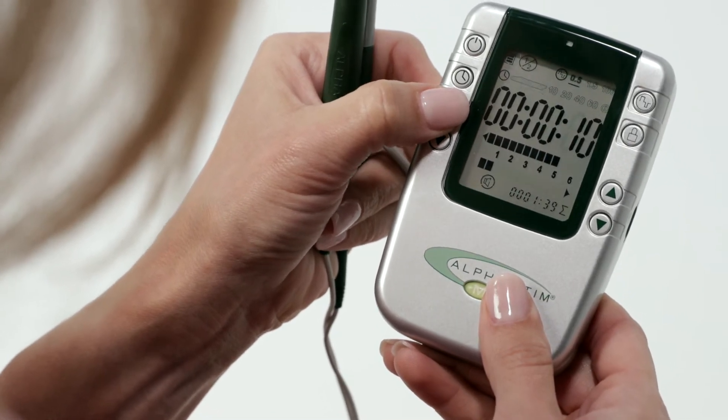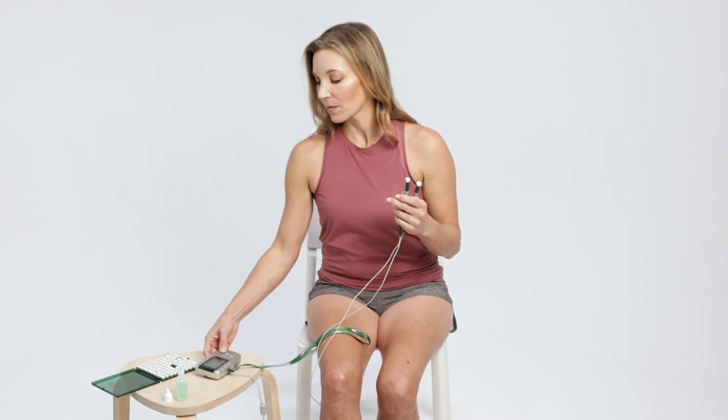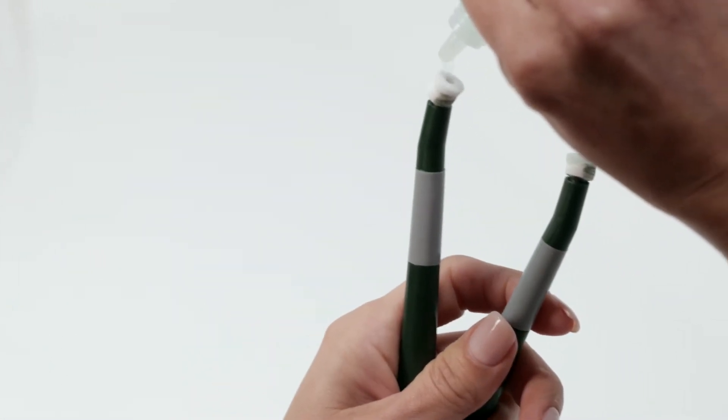Decrease immediately if uncomfortable. Saturate the PEPs thoroughly with several drops of conducting solution. Repeat as necessary through treatment if probe pads become dry.